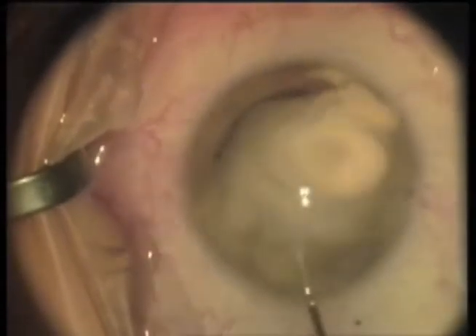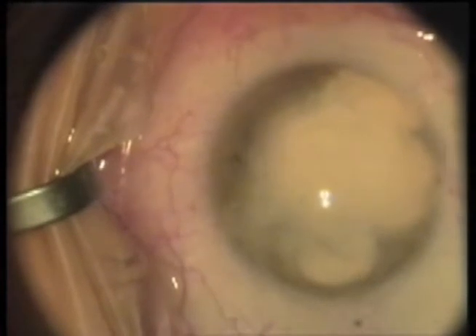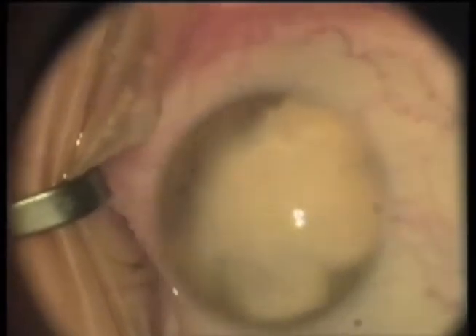As soon as you have a capsule break, the first step is to inject preservative-free triamcinolone near the paracentesis to stain the vitreous.